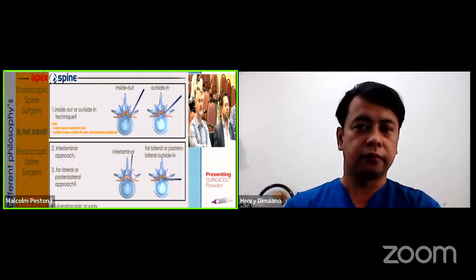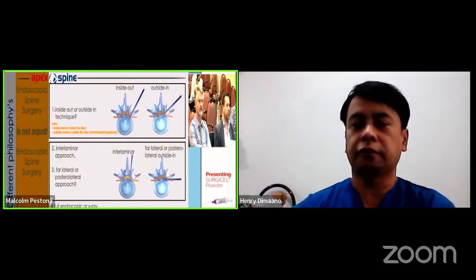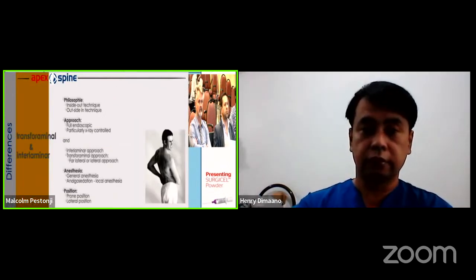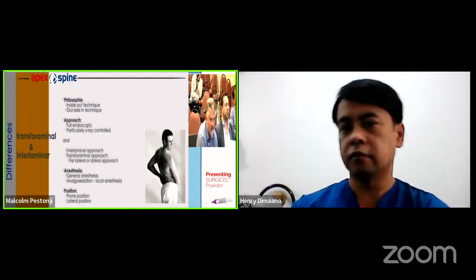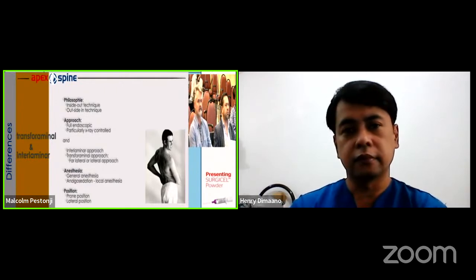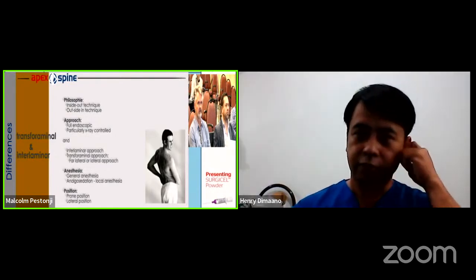Nevertheless, we have to divide between a full endoscopic or X-ray controlled access to the spinal canal, transforaminal and interlaminar. Again, it's a philosophy. If you like the inside-out technique or the outside-in technique, if you like it full endoscopic or partial X-ray controlled, you can do it interlaminar or transforaminal. For example, you can perform it in general anesthesia, or what I never do, I do it in local sedation, and maybe that's the reason that I never had one nerve damage in 10,000 cases.